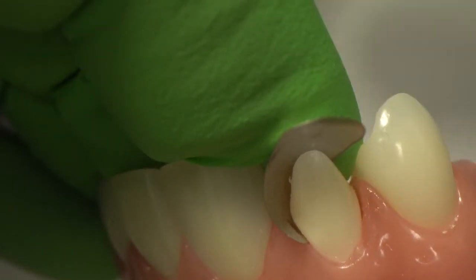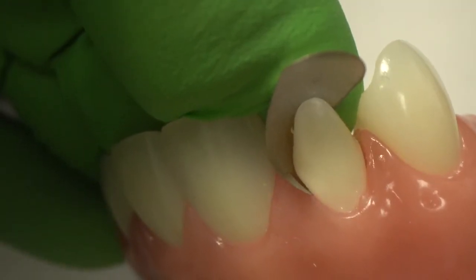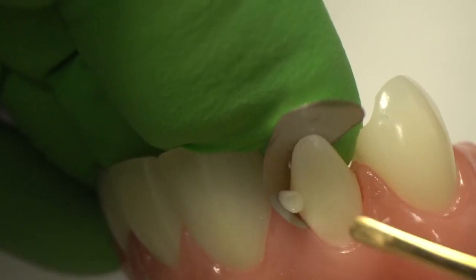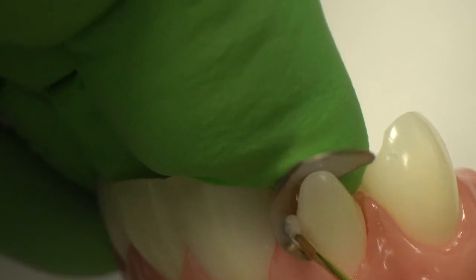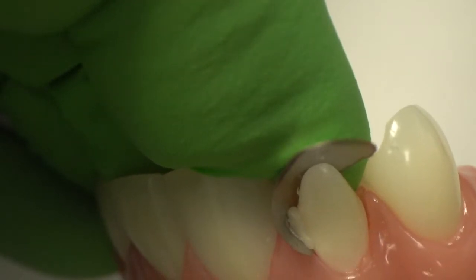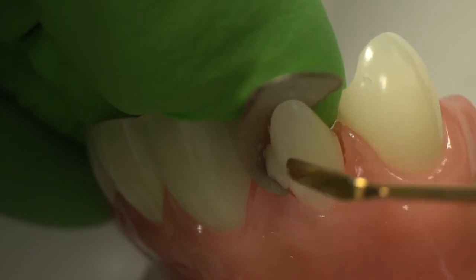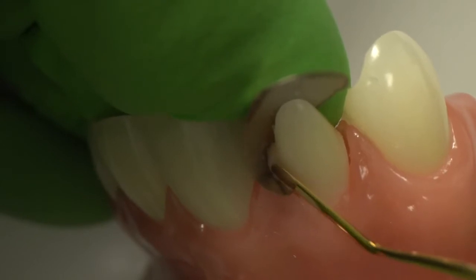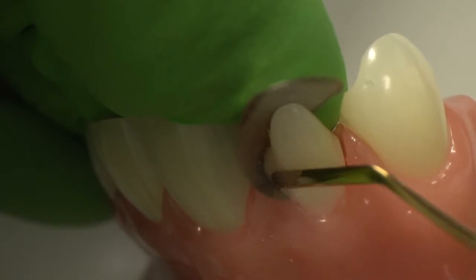Once we have our matrix in position, I'm going to take my composite with the tip of my thin instrument — the IPC instrument. I'm going to place this material and blend it. The matrix band is sealing at the cervical; that's a critical part, and I'm using my forefinger on my non-dominant hand. I only want that composite to support the subgingival emergent profile. It does not need, and it shouldn't, go up towards the proximal. I don't want to build the proximal wall at this point — we'll be using the putty matrix to help us do that.